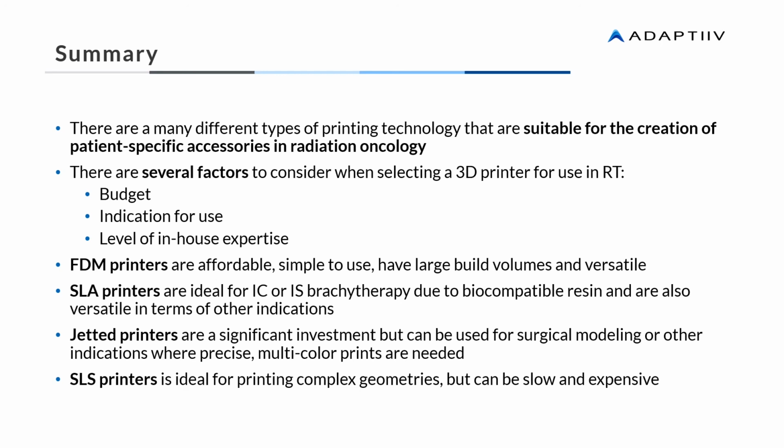FDM printers are affordable and can be used in a variety of applications. The printers are simple to use and are suitable for beginners. Also, FDM printers come with larger build volumes, so you are less limited in terms of the size of the accessories that you can print.